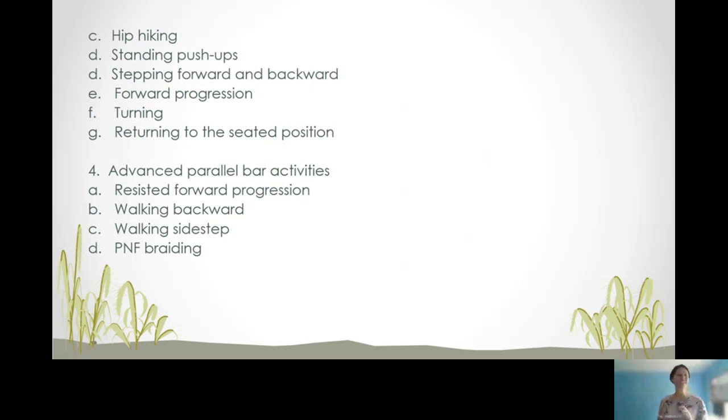Be sure to adhere to your precautions and contraindications, especially when it comes to replacements. From there on, they return to the seated position, either on the chair or back in their wheelchair, depending on their endurance. You now measured the time that they've been walking, or you've measured the steps, or you've gone once to the chair and back.